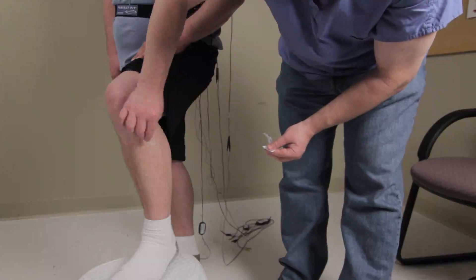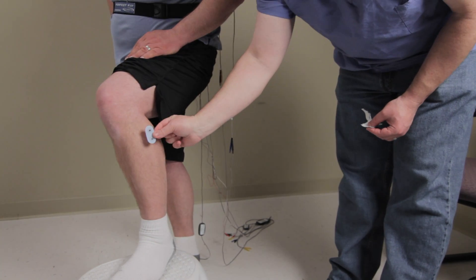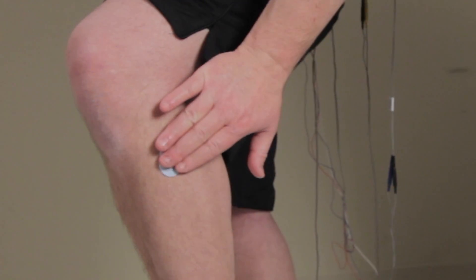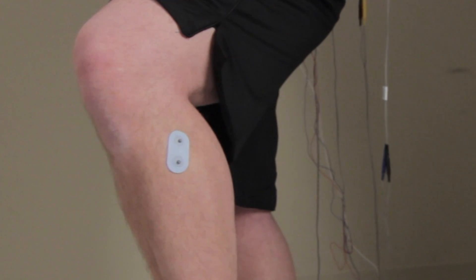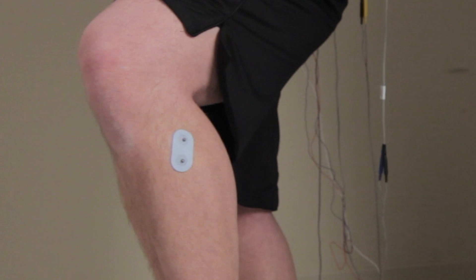As with all electrodes, proper prepping of the skin is vital to good impedance. Remove from the card and place over the anterior tibialis muscle. The two electrodes per leg are spaced one centimeter apart for low noise and to prevent bridging. These are single patient use and have a one-year shelf life.